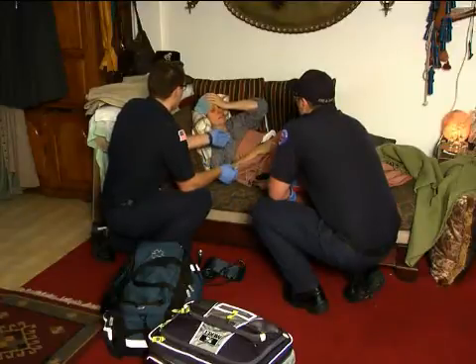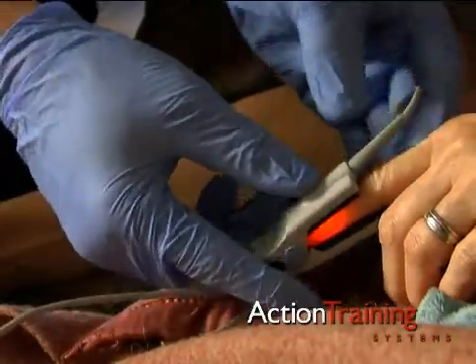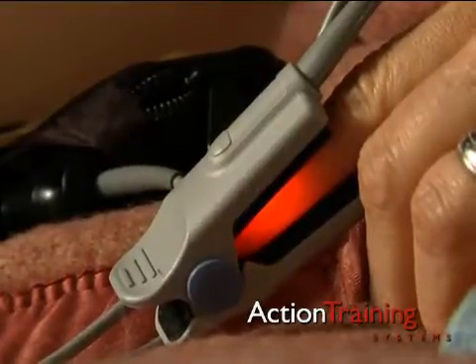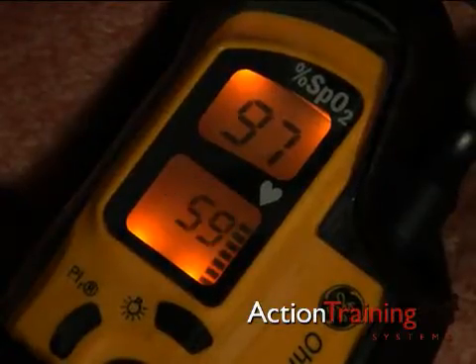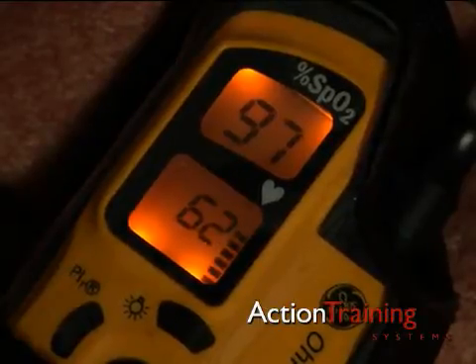To use the pulse oximeter, connect the sensor lead to the monitor and apply the clip to the patient's finger. Turn the device on. It will shine an infrared light through the body to a sensor and detect arterial blood saturation. It will provide a reading on the heart rate and a reading on blood oxygen saturation as a percentage of SpO2.